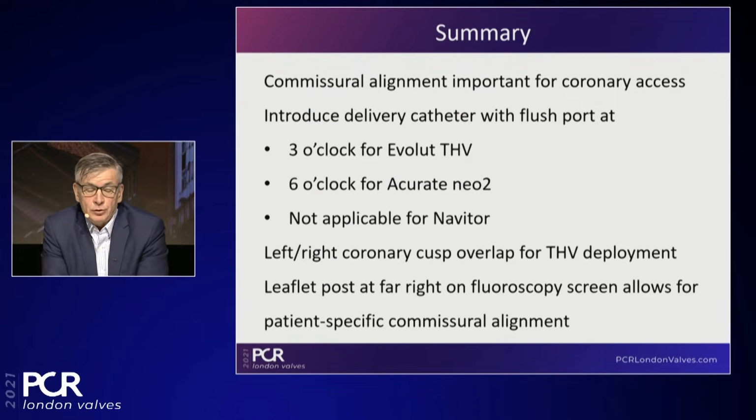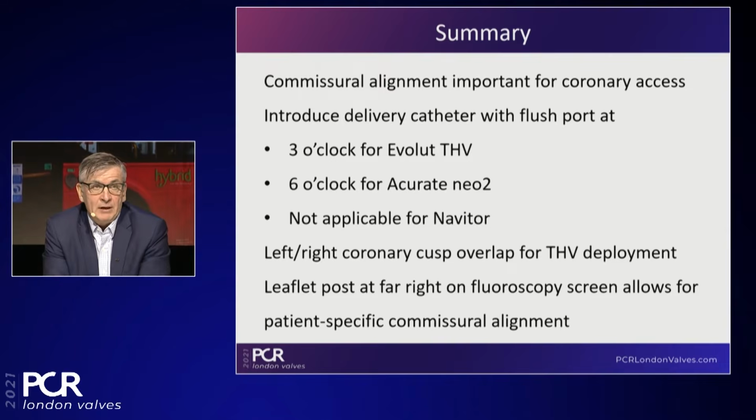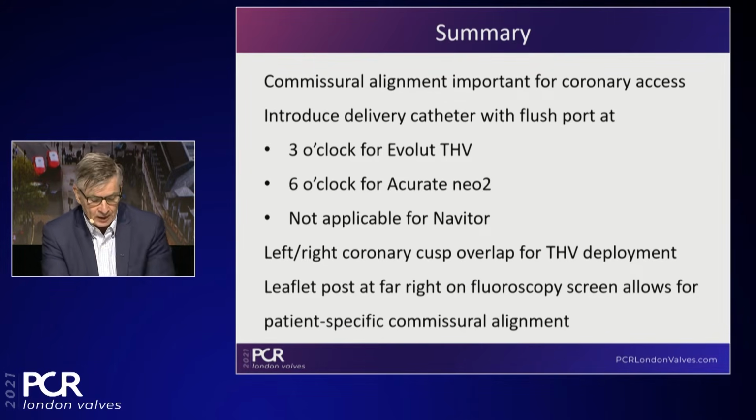So here, just to conclude, commissural alignment is important. You can start to introduce the delivery system with the flush port in a certain direction: 3 o'clock for the Evolut platform, 6 o'clock for the ACURATE one. Then you go to this cusp overlap view, where the left-right cusp is overlapping, and you just make sure that one of the leaflet posts is positioned on the right-hand side of the fluoro screen.